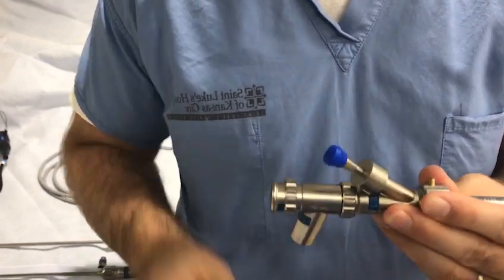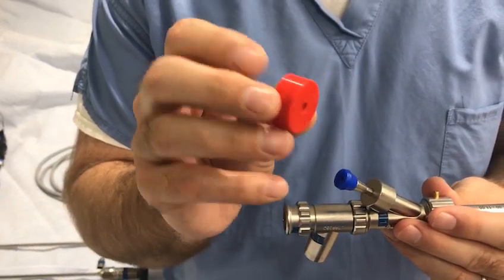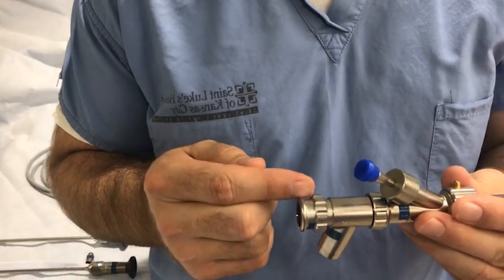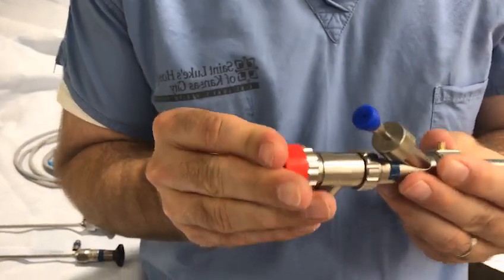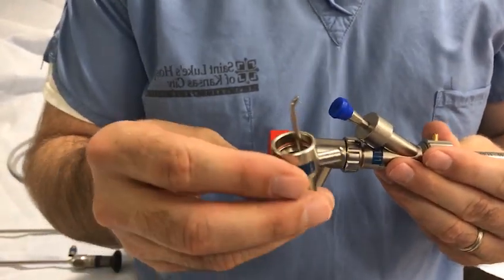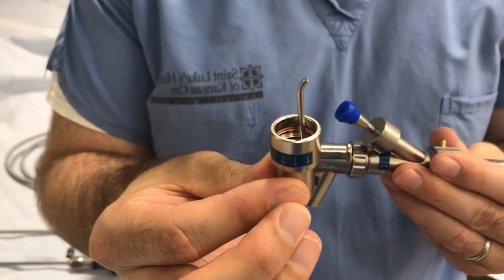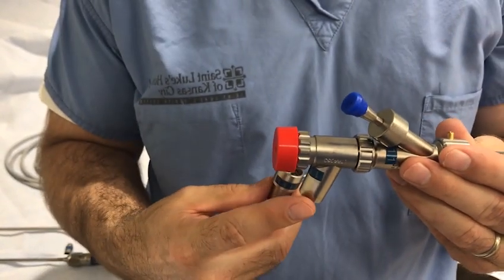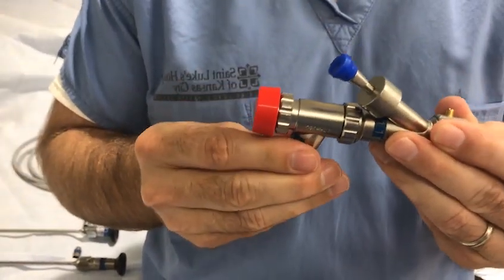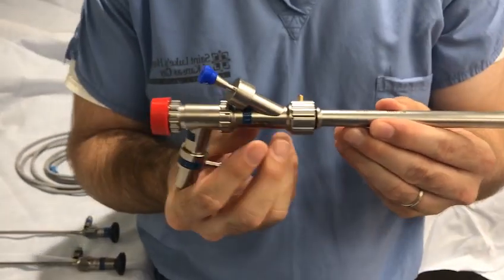Then attach a red silicone cap to the lip of the anesthesia connector. If you are going to use jet ventilation, you will need a jet ventilation adapter, which connects to the bottom portion of the anesthesia connector. If you are going to use controlled ventilation delivered by the anesthesia machine, you will attach the tubing to the connector at the bottom aspect of the anesthesia connector.